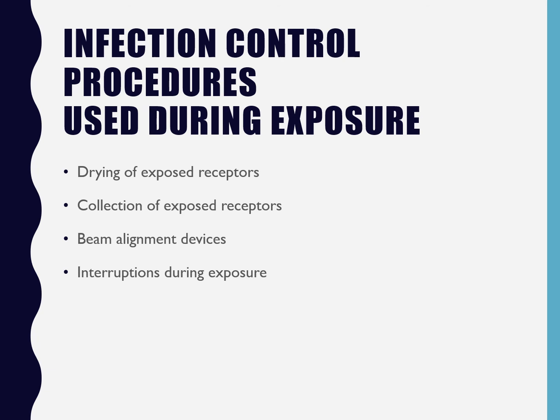But if you're going to have your 4 bite wings placed out, you're going to have your PAs all laid out exactly the way that you're going to take them, so that when you come over and you look at the paper towel where all of your films are, you're able to just pick up the next and know exactly where you're going to take it. The same thing with the sensor. You're going to come over and you're going to be pushing the button, and then you're going to know exactly which radiograph you're going to take next, because the computer is going to help guide you through those.